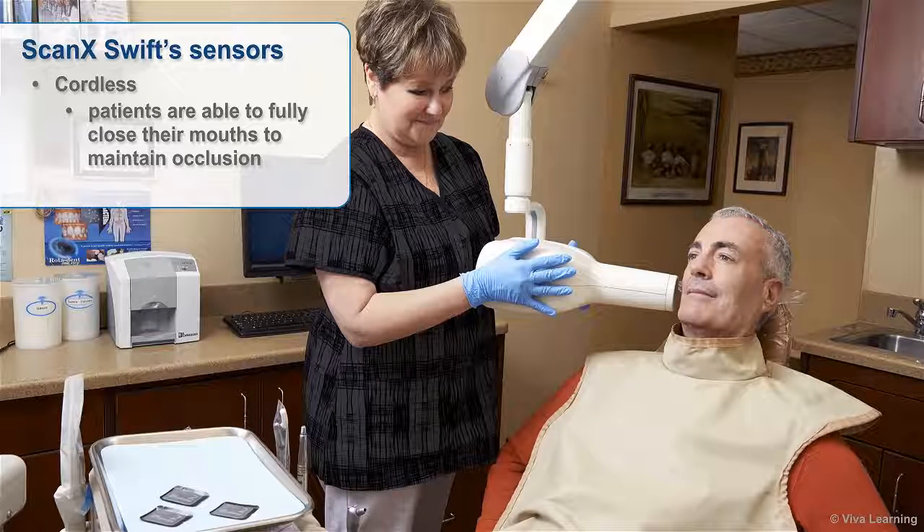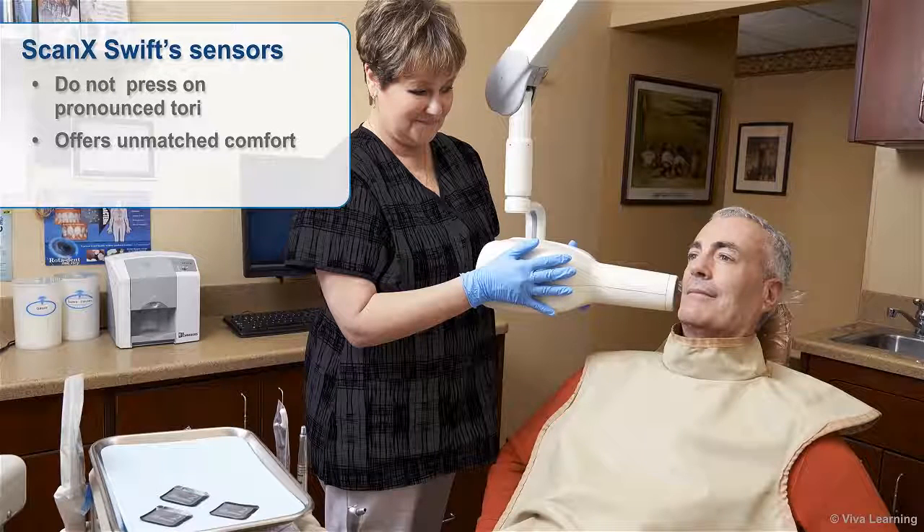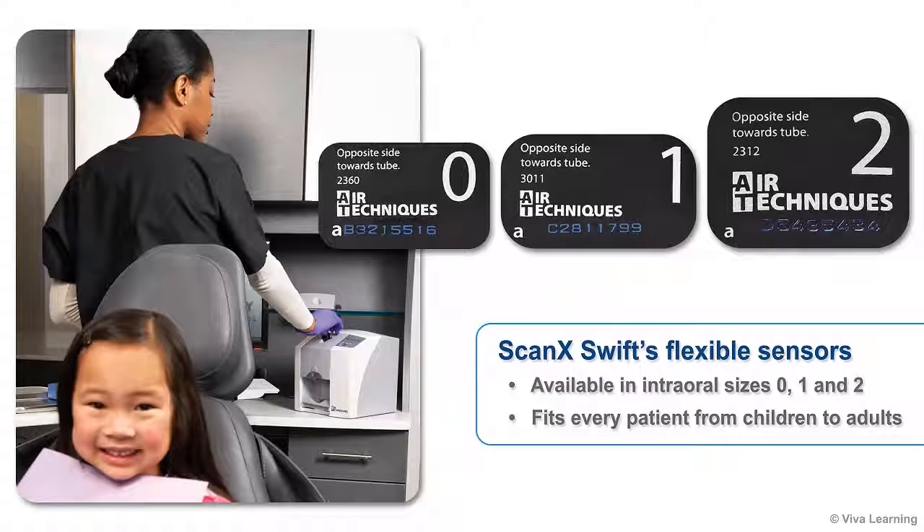With ScanX Swift, patients are able to fully close their mouths to maintain occlusion. ScanX Swift's flexible sensors are easier to position for taking radiographs of posterior teeth and are able to fit where wired sensors don't fit at all. They don't press on pronounced tori and they're comfortable for patients with small mouths, strong gag reflexes, or difficulty opening wide. Available in intraoral sizes 0, 1, and 2, they're designed to fit every patient, from children to adults.